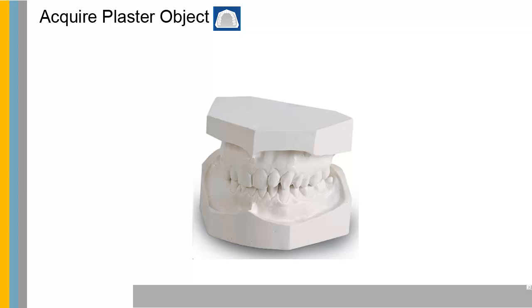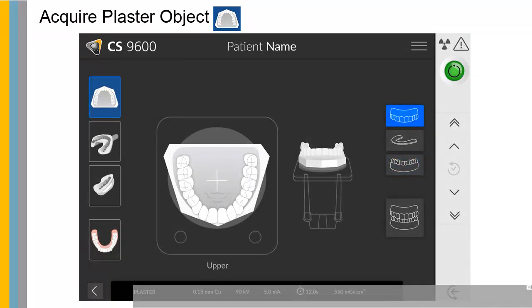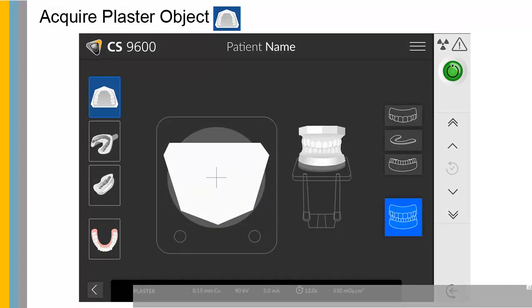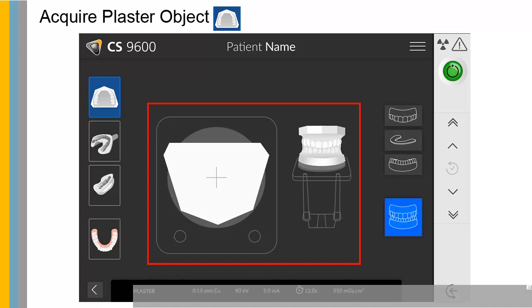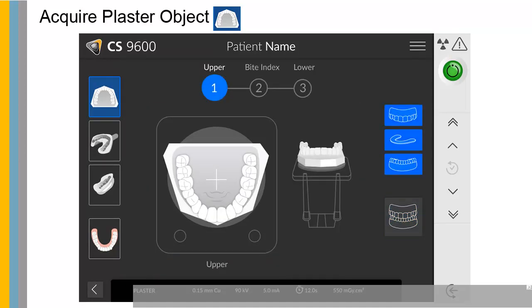To acquire a plaster object, click to launch the plaster object acquisition. Select lower jaw, upper jaw, or full jaw mode. See the on-screen illustration on how to position the lower jaw, upper jaw, or full jaw plaster at the center of the black foam.